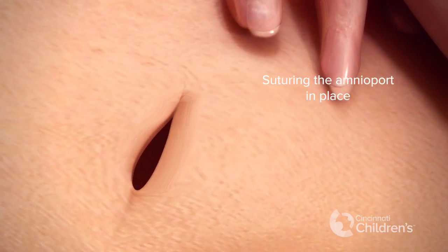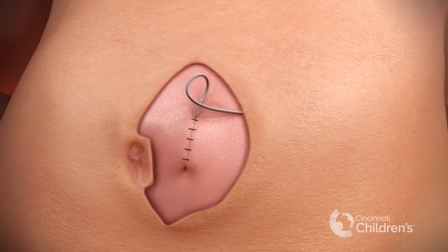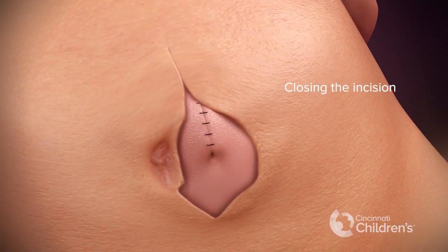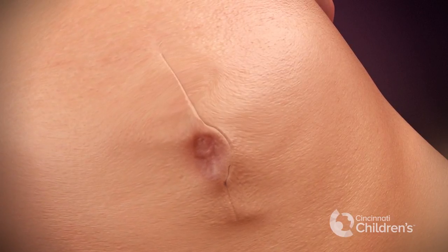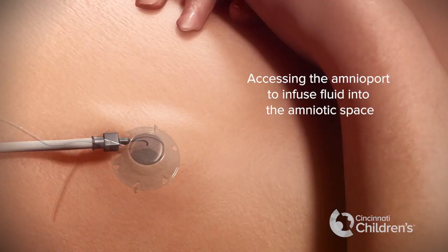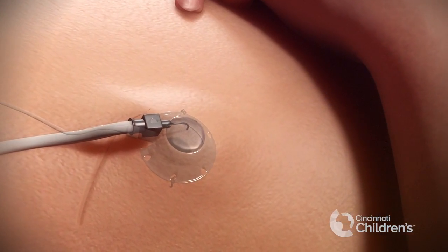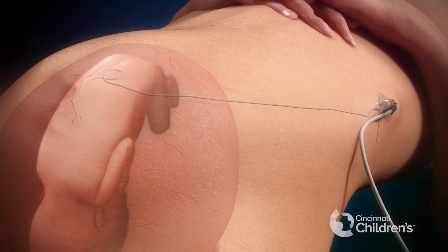The incision is then closed over the reservoir. Finally, the maternal abdomen is closed. This allows us to access the amnioport reservoir with special needles to infuse fluid into the amniotic space — fluid that is necessary because the fetal kidneys no longer make urine.